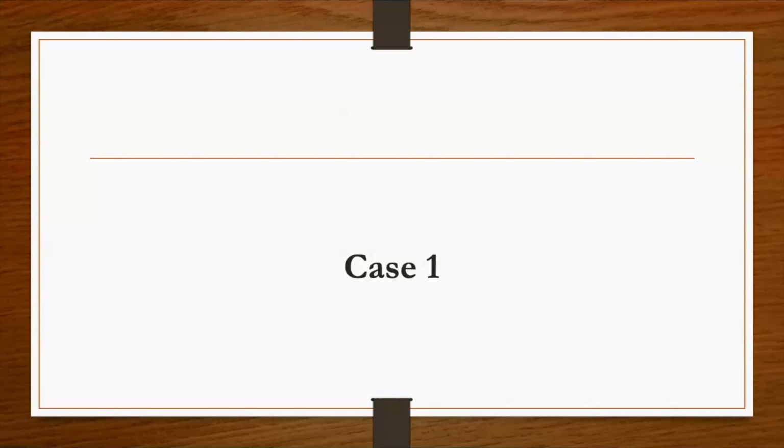Hi. Yes. Before we start the cases, I know RV is one area that we don't really optimize. We usually assess the RV just based on the TAPSE or the S prime, right? So my question is, how do we optimize the RV?